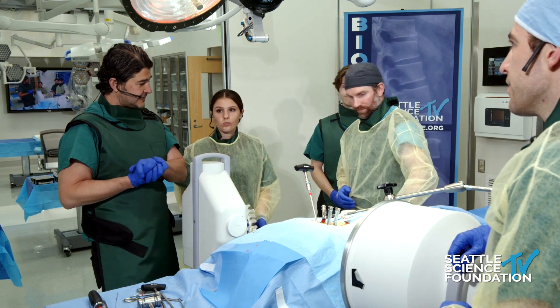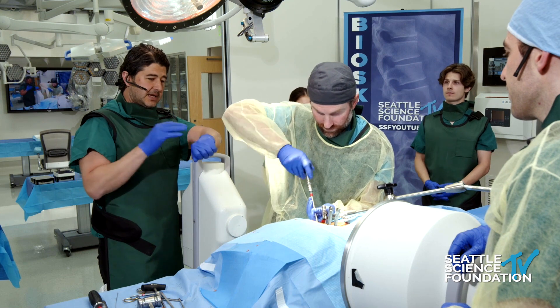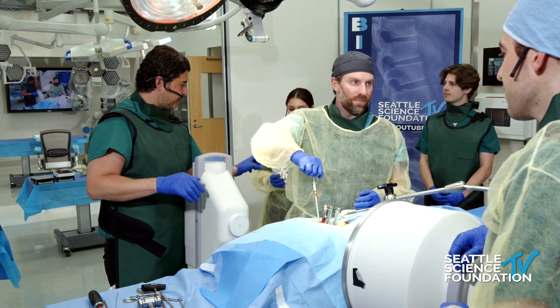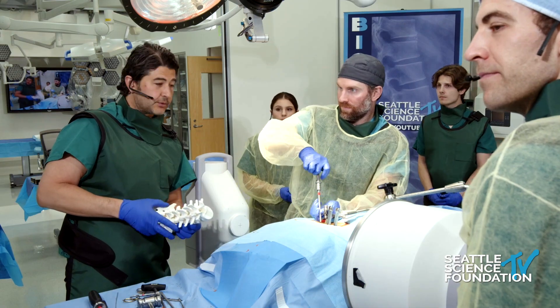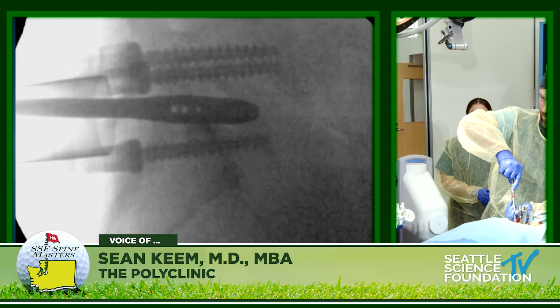Now Chris is doing the discectomy. It's so difficult to do a full discectomy when you're doing it open. You can see how much of the disc — can you guys see that on the lateral?